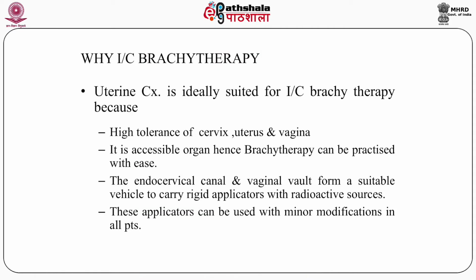Why do we use brachytherapy? This is a very important question. Uterine cervix is ideally suited for intracavity brachytherapy. In the uterine cervix, the hollow space is there, and there is high tolerance of cervix, uterus and vagina.